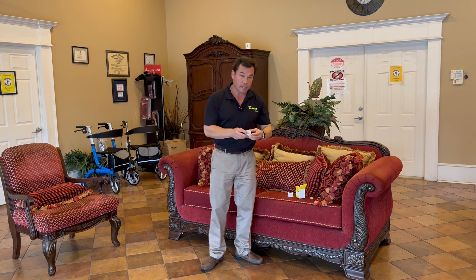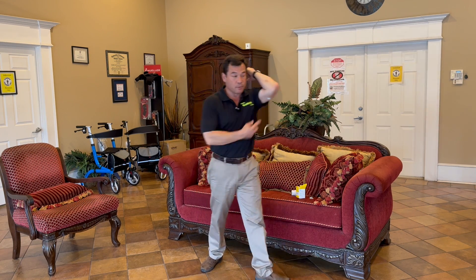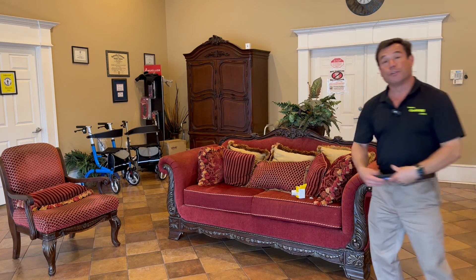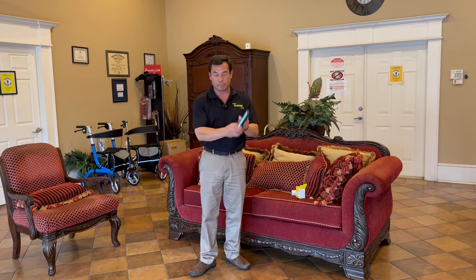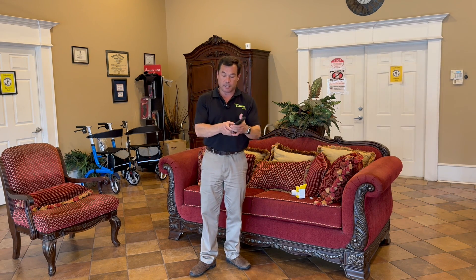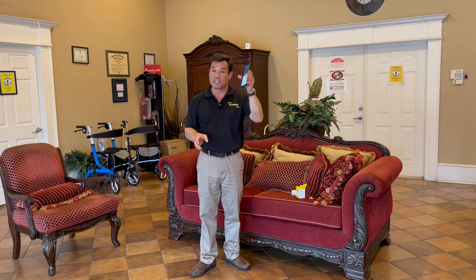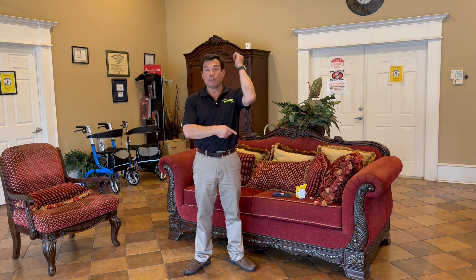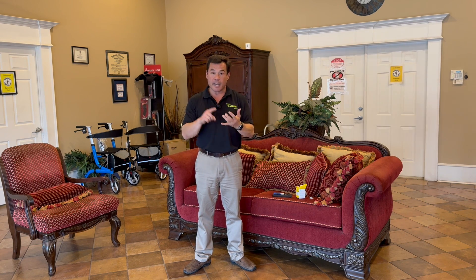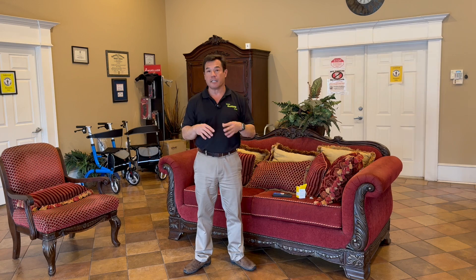Like the Freestyle Libre 2, this one also takes a moment for the sensor to match up with your phone. It'll say it's been applied, and then you're going to scan the new sensor — you don't even need to put it that close. It is scanned and it is beginning to search. Like the Freestyle Libre 2, it will take one hour for your phone and the sensor to begin speaking to one another, and for the sensor to begin to automatically adjust itself to your body chemistry.